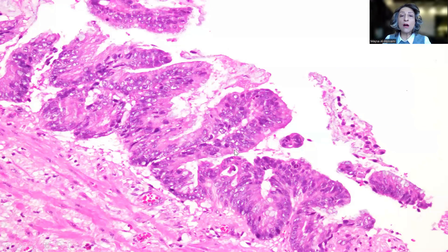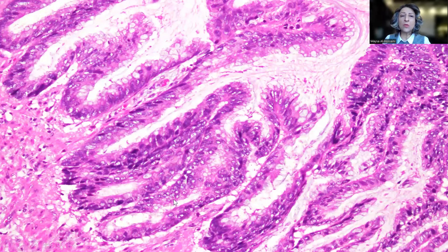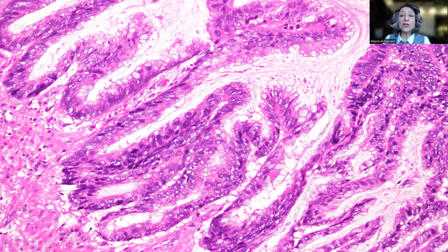On high-power magnification, it's very clear: the high-grade nuclear features, the stratification, and the villiform transformation of the surface. Even more here, it's much crisper and clearer — we have the villous transformation of the surface epithelium, which is lined by highly atypical, highly malignant cells very reminiscent of high-grade dysplasia in a villous adenoma of the colon.